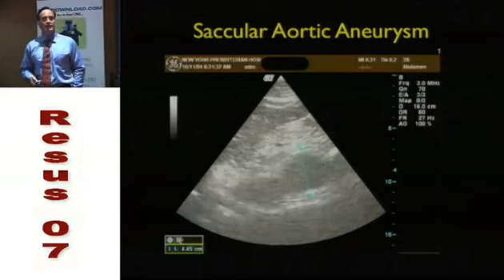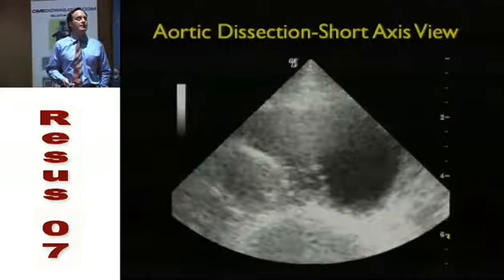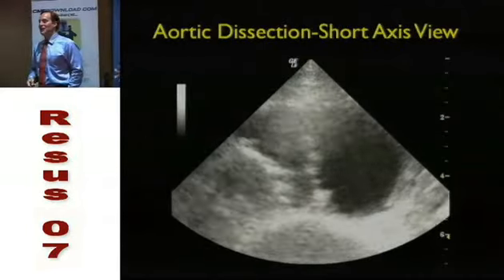So actually, this patient got admitted and had surgery as well. So a saccular one. Now, I think this is what they were talking about in the ER clip.